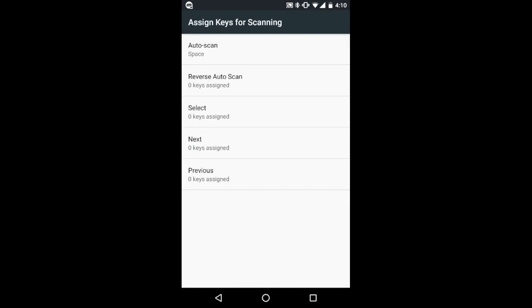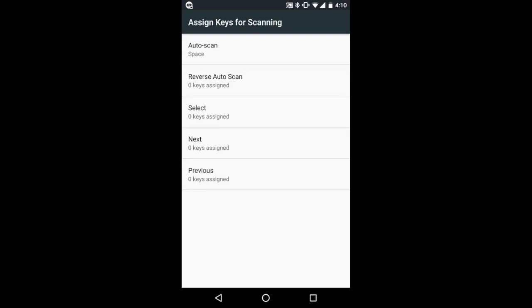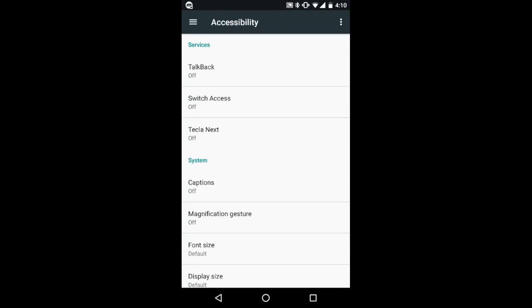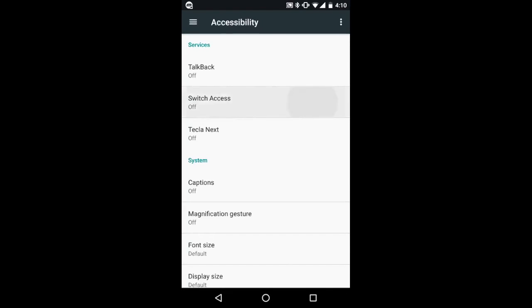If you are not using auto scan, turn off auto scan, go to assign keys for scanning, select a scanning action, i.e. select.